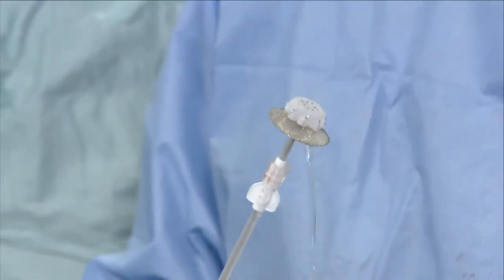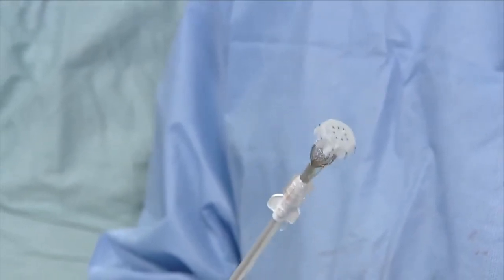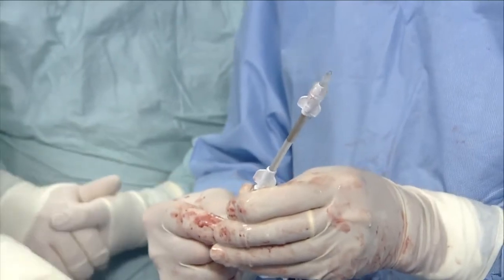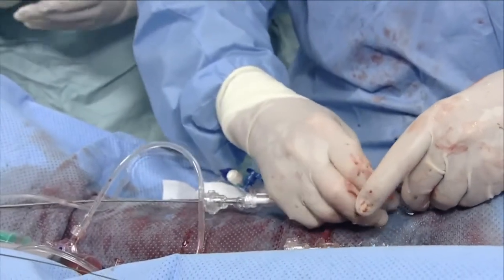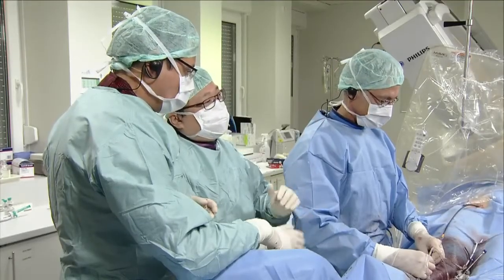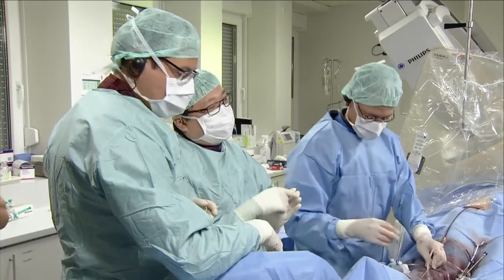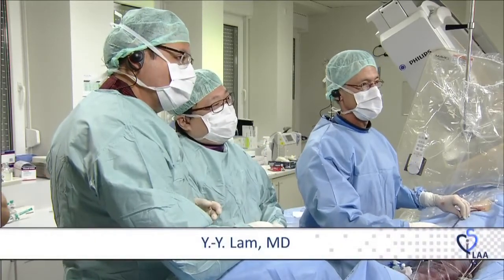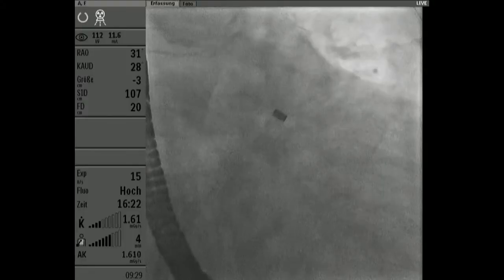Horst, did you say this was 18? It's 18 and 32. Okay. What made you change up from 16? That was Yatin Lam. Why? In this case, because you measure the ostium is around 25 for the 18 device. When you implant it, the disc will be around 32, but because it is like a satellite disc structure, it will curve inward, so it will lose maybe 3 to 4 millimeters. So after implantation, the disc, if you measure the longest diameter, will be less than 32. Based on the ostium measurements, if you choose 18, the cover will be 2 millimeters larger, so the chance of better sealing the ostium will be higher.